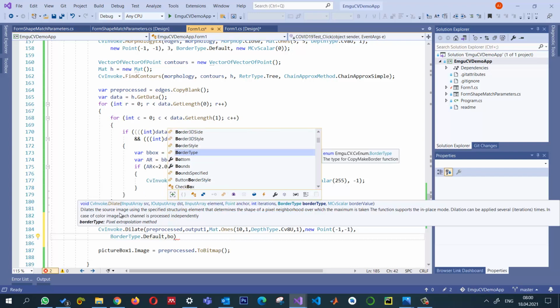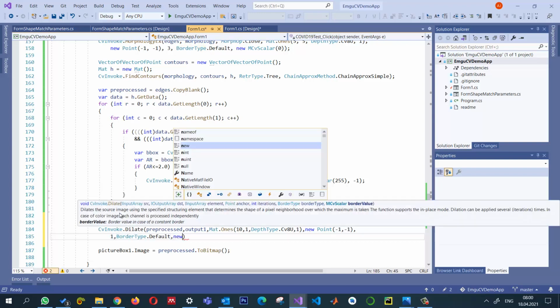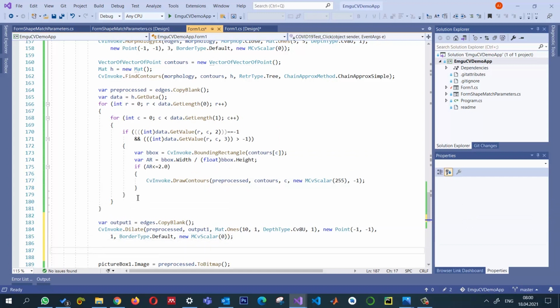And the third one is the border type. The next one is the number of times that we want to repeat it. I say only one time. And we have this border type, and what should be the value? Let's say 255. Okay, or maybe let's set it to 0, for example. Okay, so this one will result in the dilation.